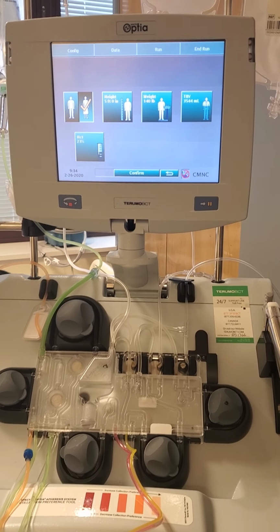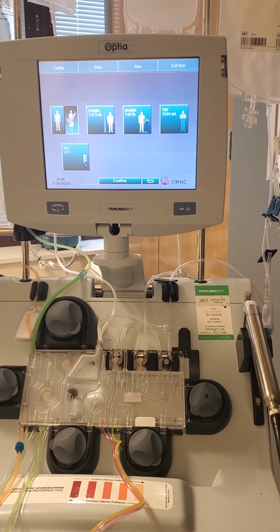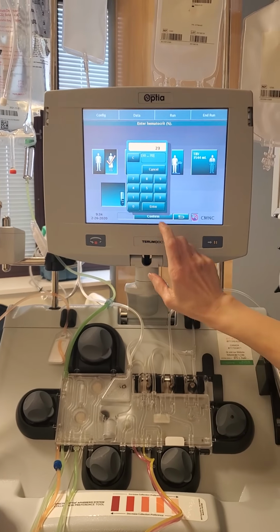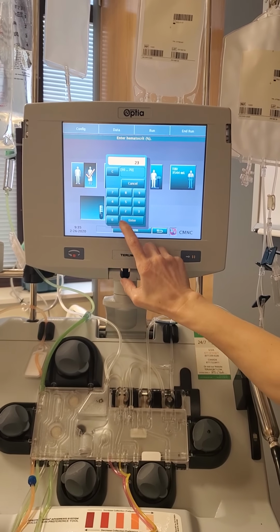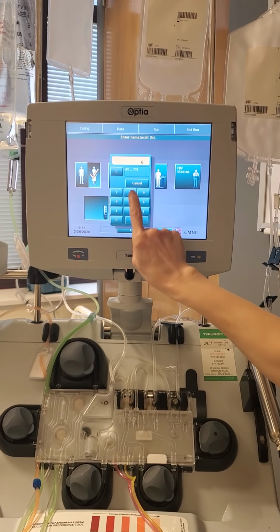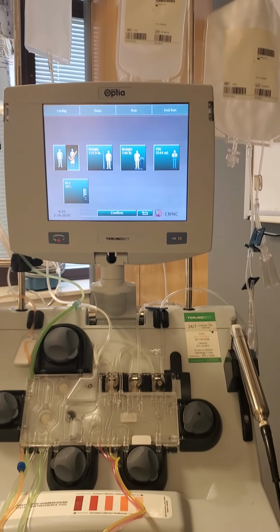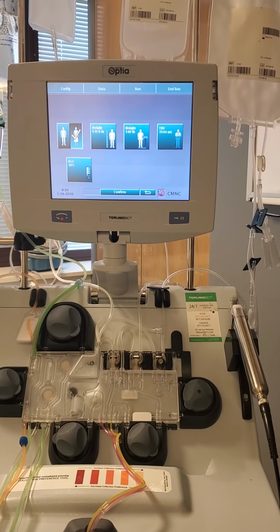So what if you have a hematocrit level that's not accurate on the day of collection? Let's just say that it was done maybe 3 or 4 days ago. Would the machine tell us that interface... Let's set it too high so you can see this. Okay, make it 30%. It shouldn't be that high, but we'll see. Just type over it. 30%. All right, so now we're telling the machine that the patient's hematocrit is actually higher than we feel it is.